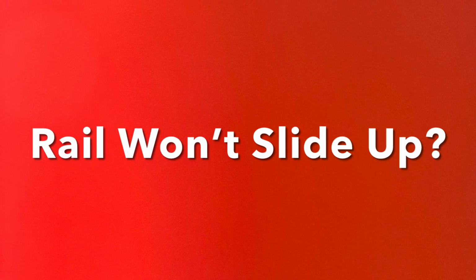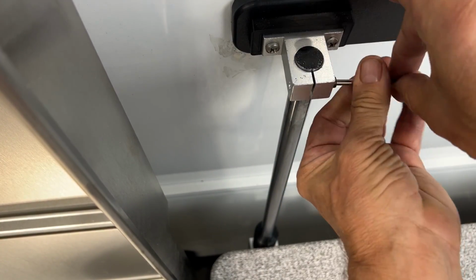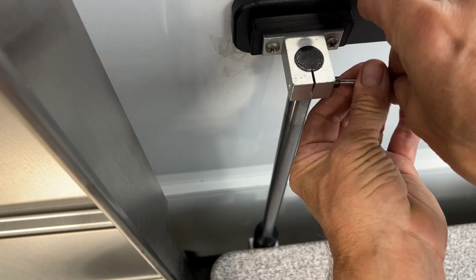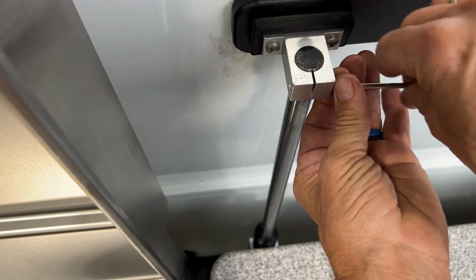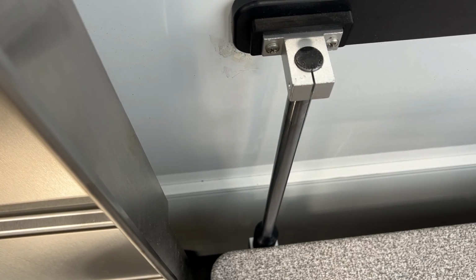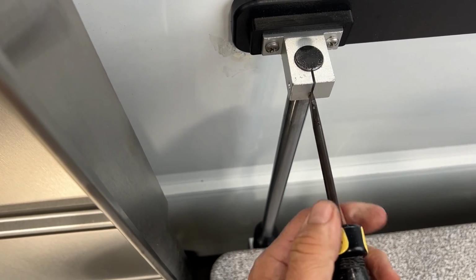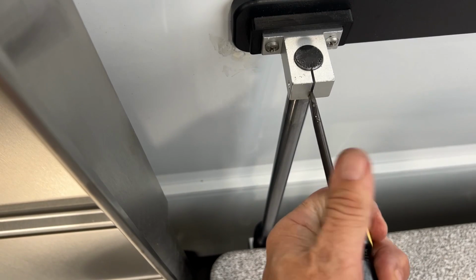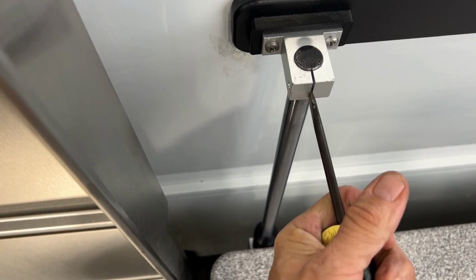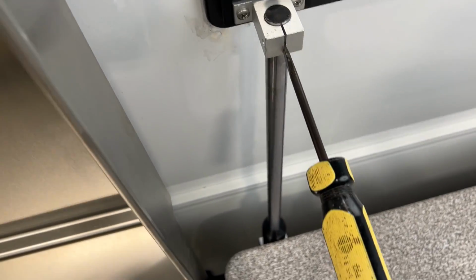If the rail doesn't move when you're pushing it up, you may have to expand the joint. The way to do that is to totally remove the screw from the bracket. Then you're going to need your straight head screwdriver, and we're going to place the tip of it in that joint that you see in the front side of the bracket. Then we're going to take our palm and push the screwdriver into that crack to open up that crack a little bit more and loosen up a little bit on that shaft.